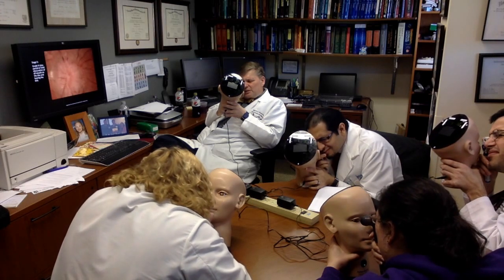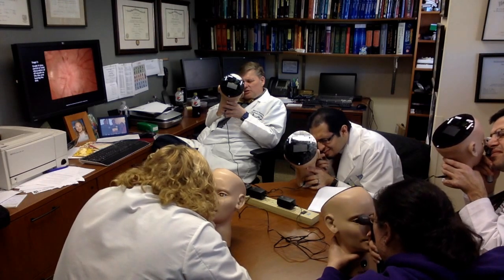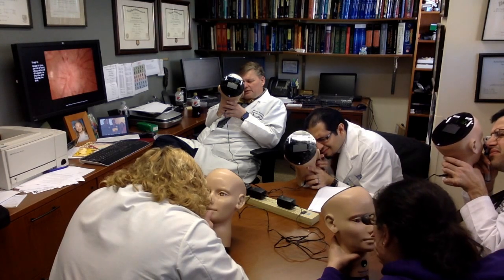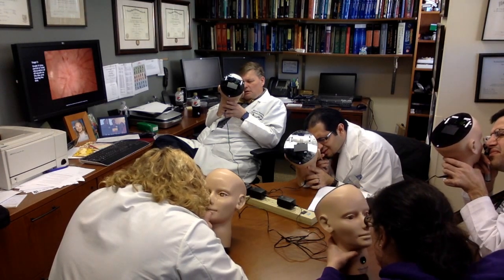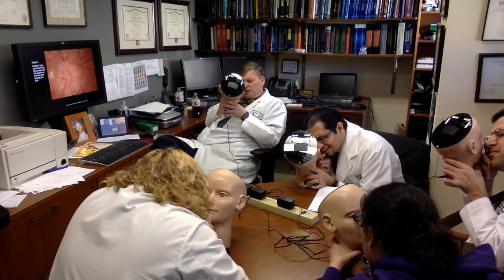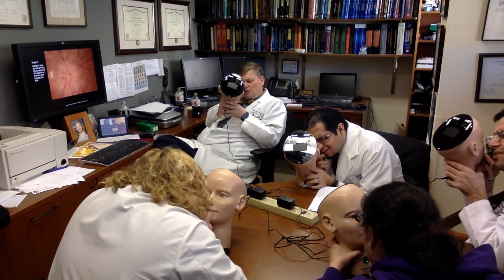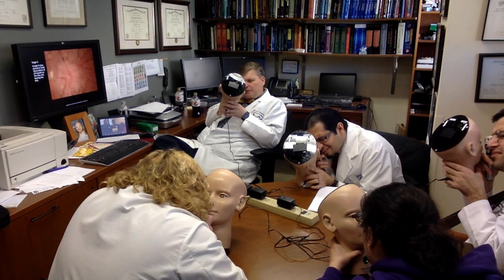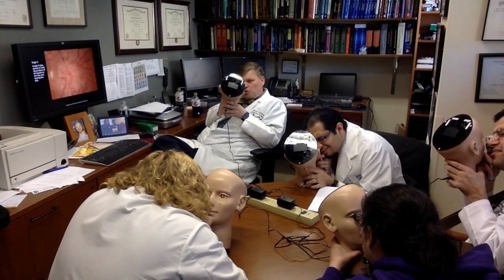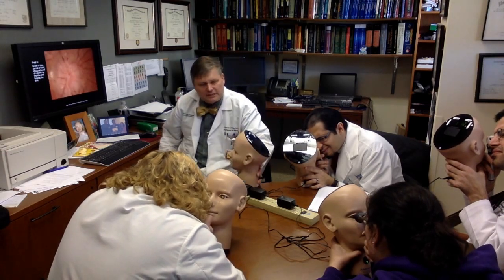This one, the retina's got some problems. We're not going to look at the retina right now, just the disc. And I'm going to ask you, what do you think about the color of the disc? It's white. Do you see any clear differentiation of the cup versus the disc? No. This is optic atrophy. The disc is like this pale moon.